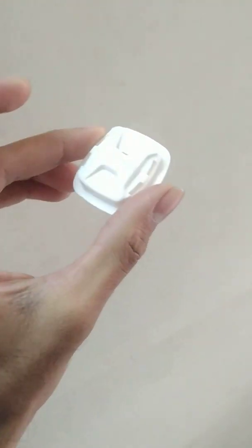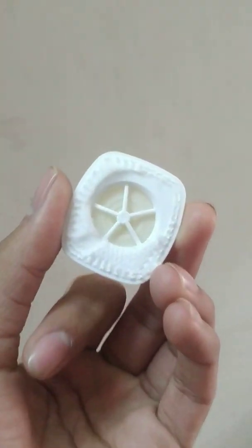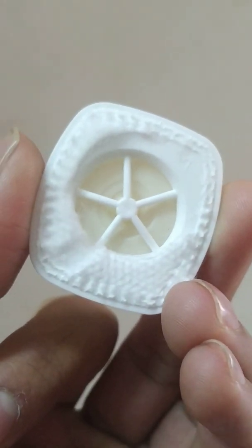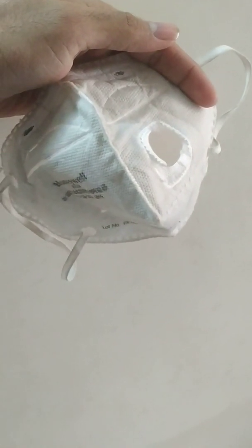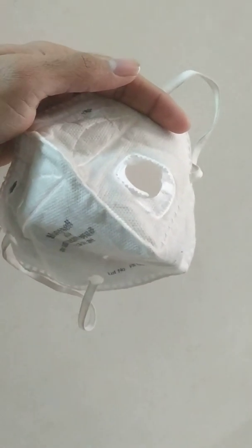This is the exhalation valve, and you can see that it has a kind of diaphragm inside. This diaphragm provides easy exhalation. I have now removed the diaphragm, so let's cut it open and see how many layers are inside.